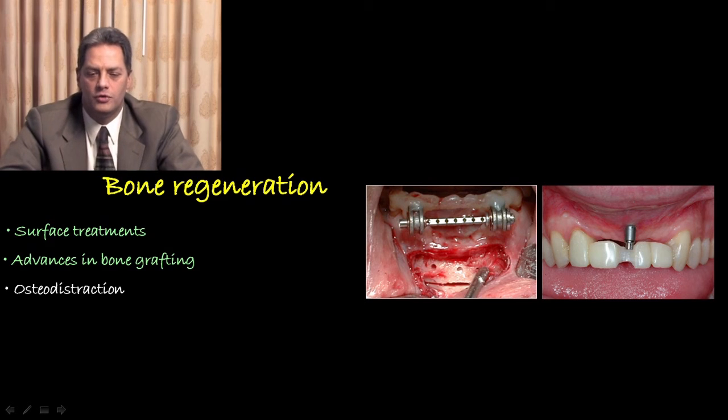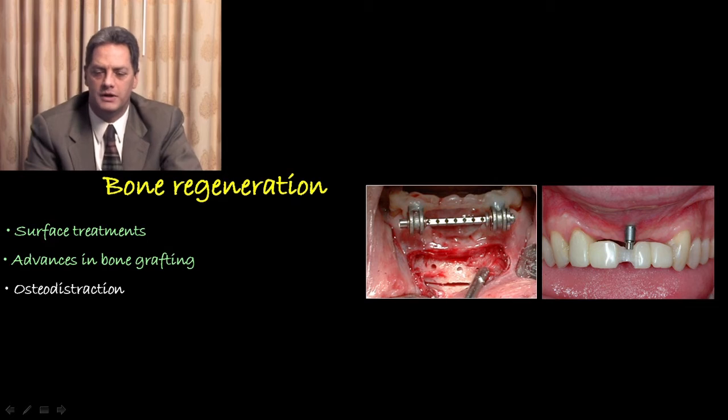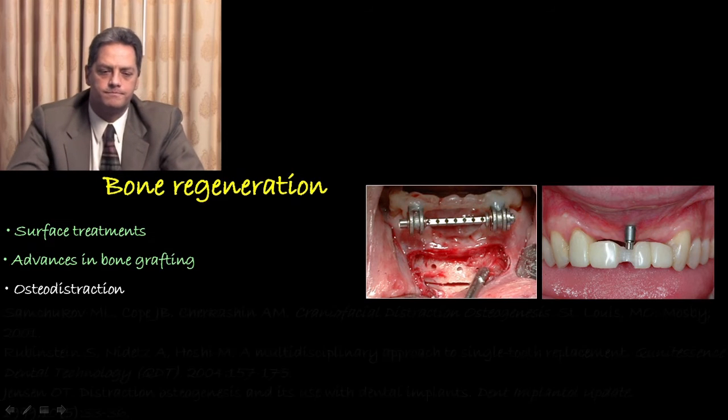Osteodistraction is done with an osteodistractor as we have here, the RAD5, which is tooth anchored, versus an osteodistractor that is anchored onto the bone. The intent is to create orthodontics of the bone and actually superrupt it, move it into a much better position, allow for 2 to 3 months of osseointegration and maturity at that level, and then be able to provide a restoration that's going to be with better profile.